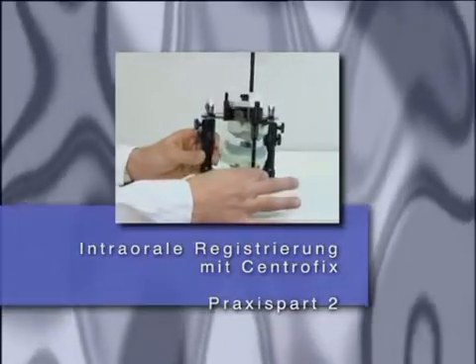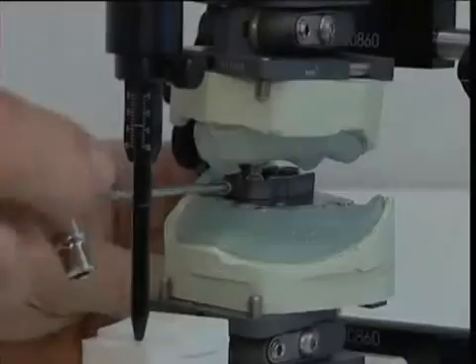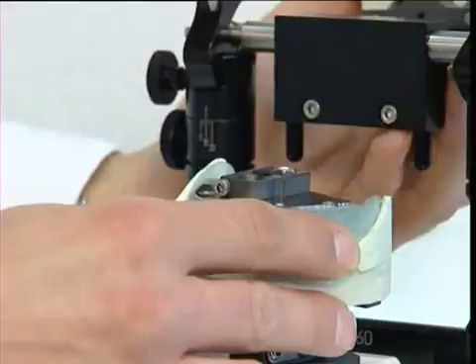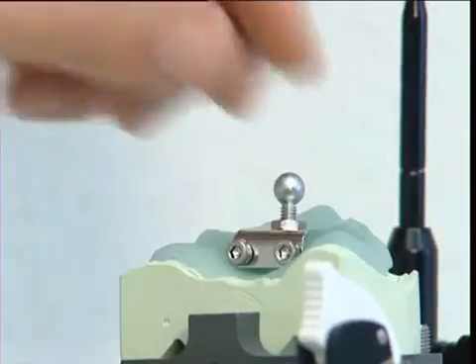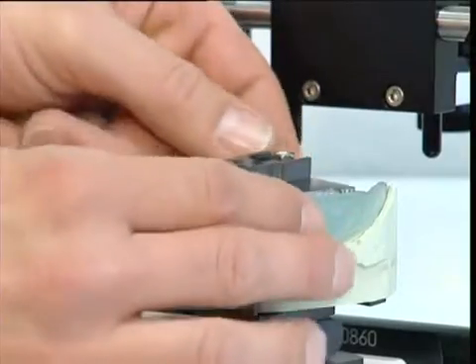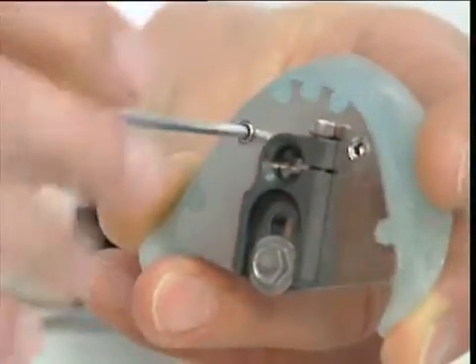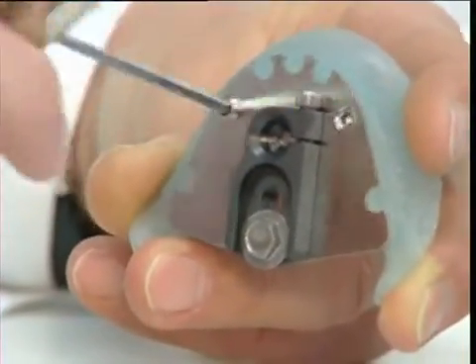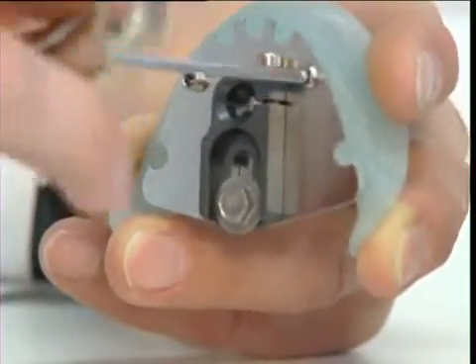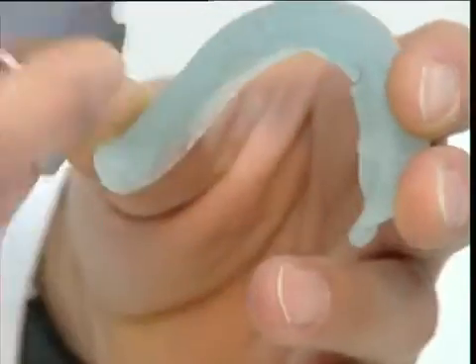The laboratory supplies the special functional trays with Centrofix registration instruments according to Dr. Lüth. The models are released and the impression trays removed from the models. Release the tracing plate from the lower tray. To do so, unwind both grub screws as far as possible, but ensuring that their threads still engage the threads of the metal tracing plate. The tracing ball remains in the upper tray during the entire impression-taking procedure.